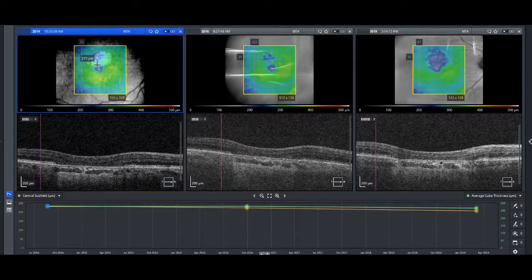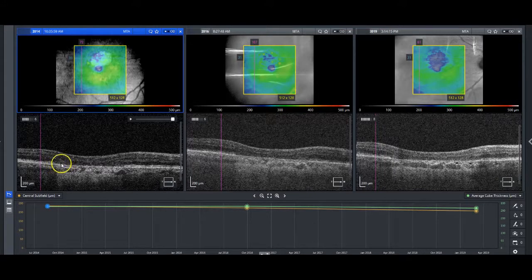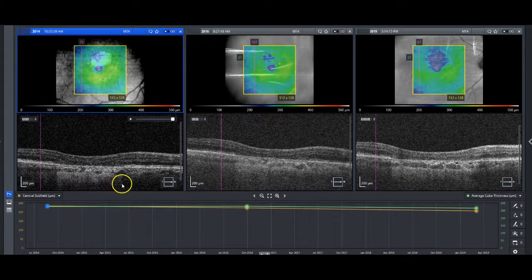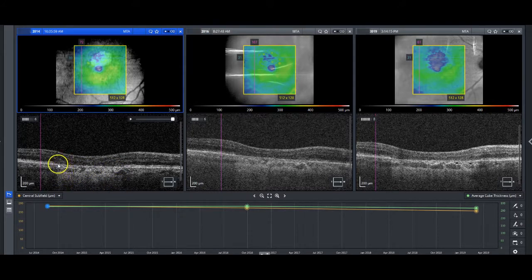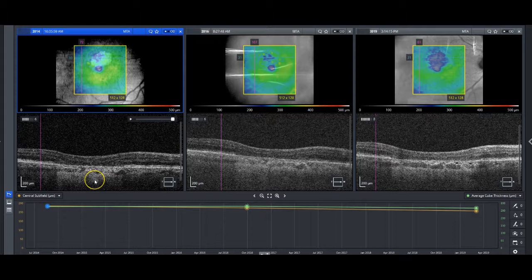Going up — where is that ellipsoid zone? It's gone. There is no ellipsoid zone in this area. You can see here this hyper-reflectivity, this transmission defect. Basically, you see the increased reflectivity because you've got additional loss of the underlying RPE, so you're getting more light from the OCT actually shining through and imaging the deeper structures.